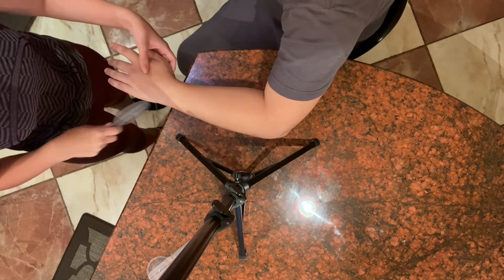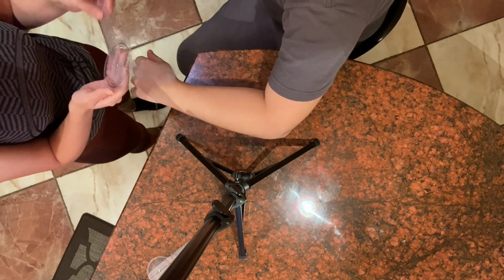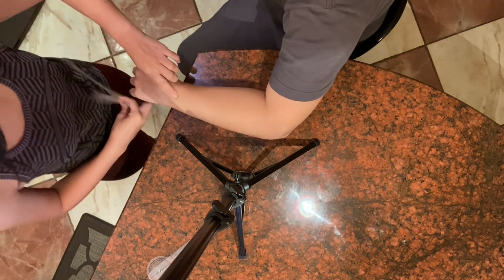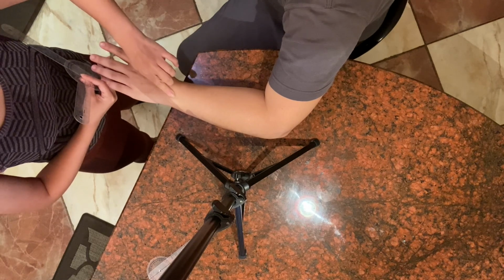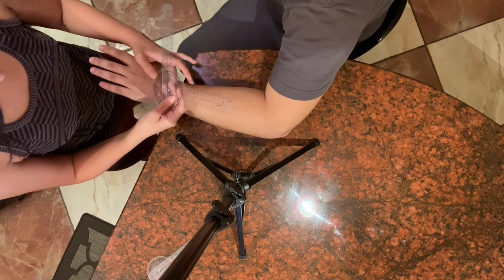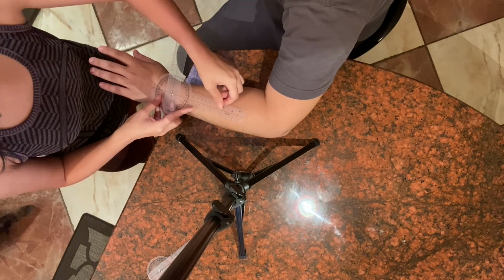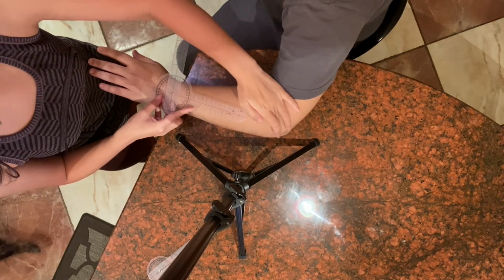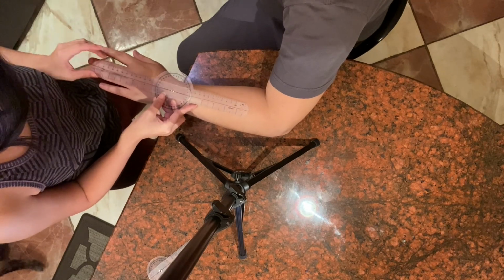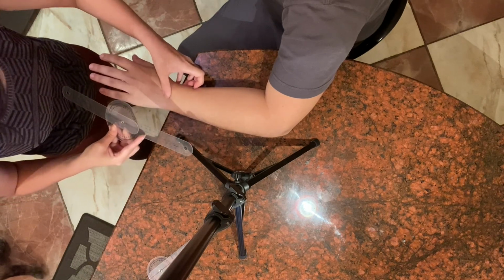As you can see, the wrist is hanging off the edge of the table, and the axis of the goniometer is going to go on the capitate, so right about there. The stationary arm is going to be along the dorsal midline of the forearm and aligned with the lateral epicondyle. And the moving arm is going to be aligned with the third metacarpal.